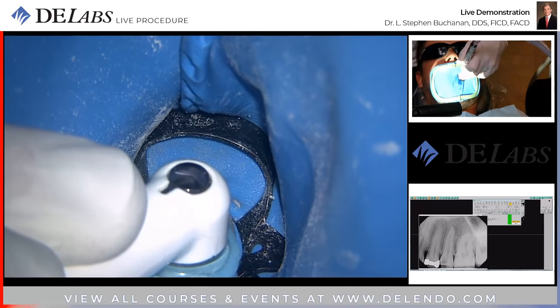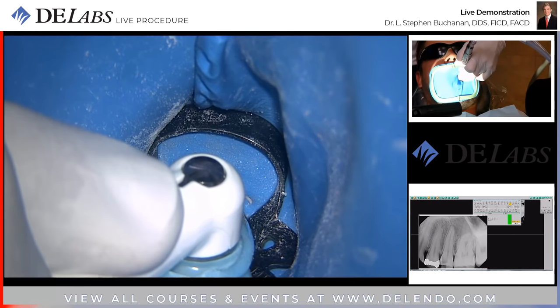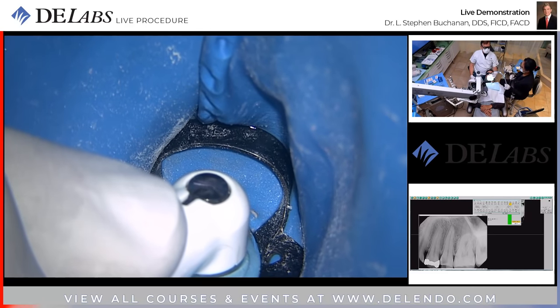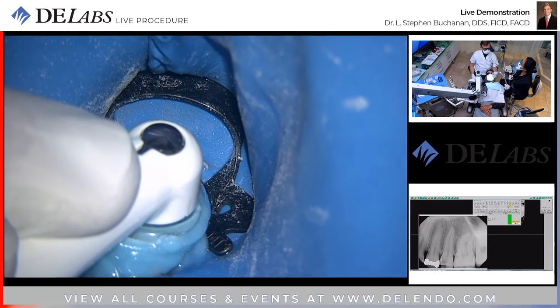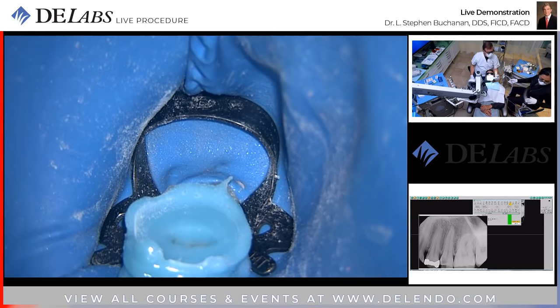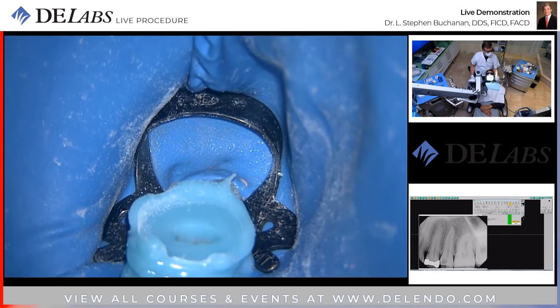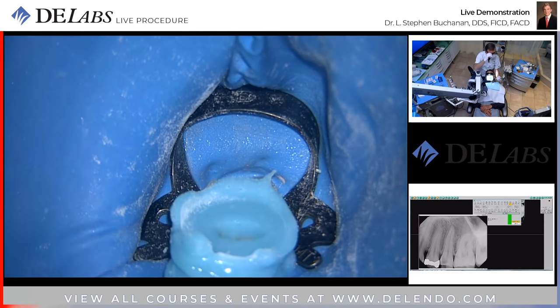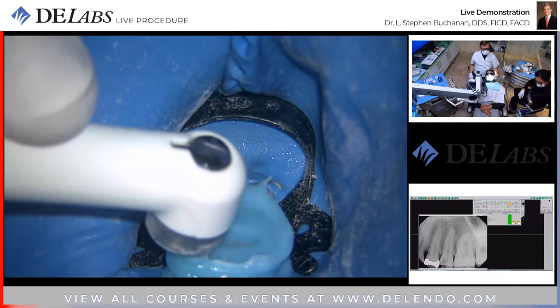Okay, so the leak test has passed. We don't have leakage in the mesial area where the two structures are missing. We're now going into the hypochlorite cleaning cycle. It's targeting 3% sodium hypochlorite. Currently, we're at about 4.8%. The hypochlorite mixture is out of range, so it's telling us it wants to have something checked out. Okay, so we're checking the fluid levels, we're checking the connections. I'm going to go back and recreate that seal.